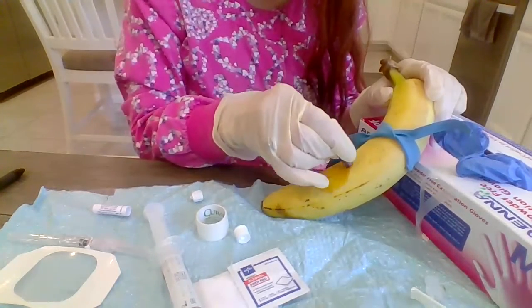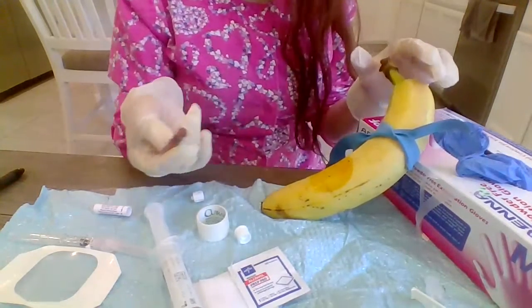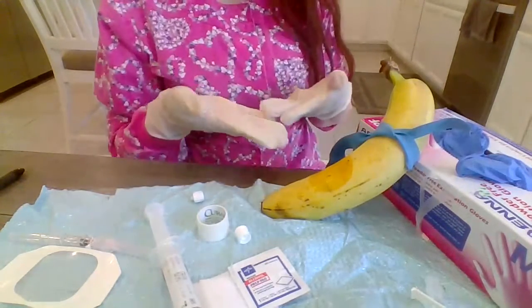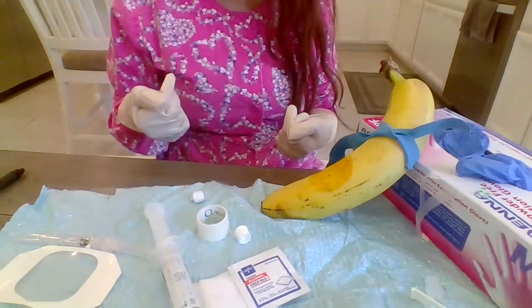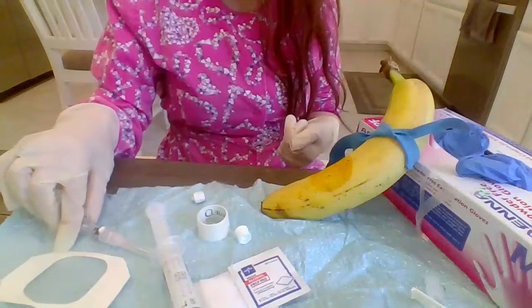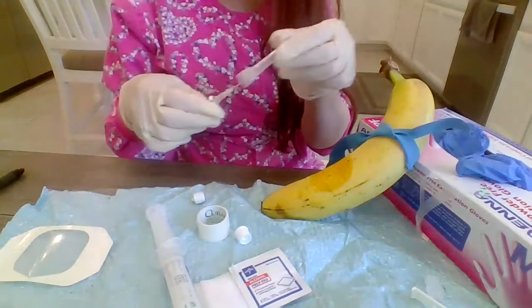All right. Now I'm going to go ahead and toss this. Let it dry. So assume it's already dried. I'm going to go ahead and start the IV.